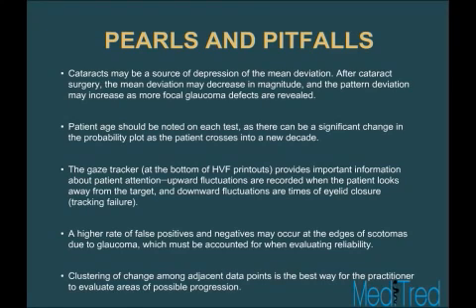And clustering of change among adjacent data points is the best way for the practitioner to evaluate areas of possible progression rather than just looking at individual points that don't have clustered depressions around them.